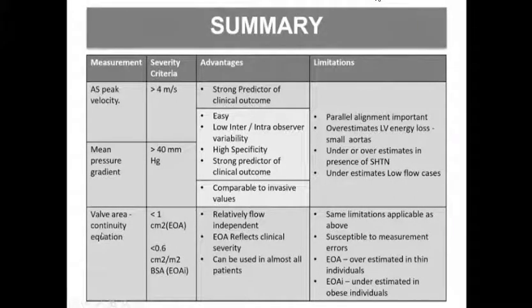So valve area by continuity equation is quite difficult. It is relatively flow independent. So clinical severity is reflected, and it can be used in almost all patients. But as we have discussed, there are a lot of limitations for these continuity equations.